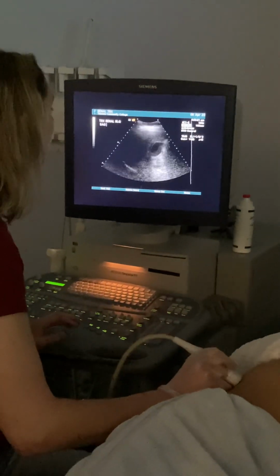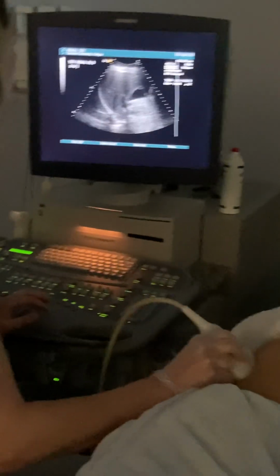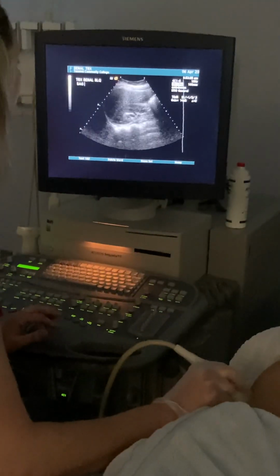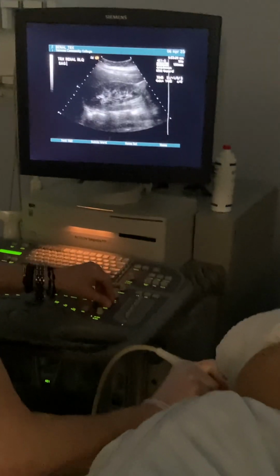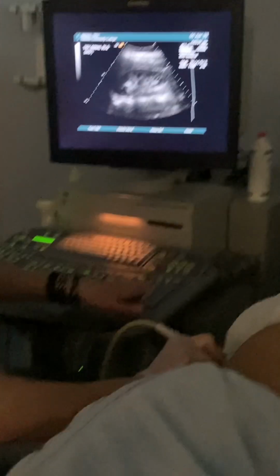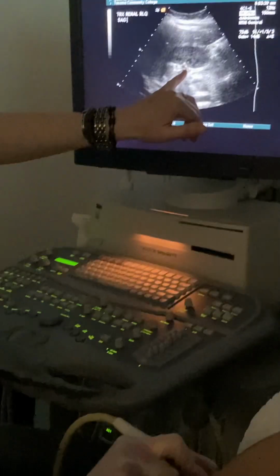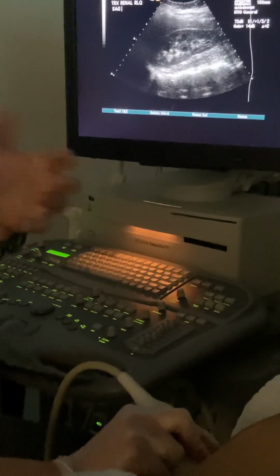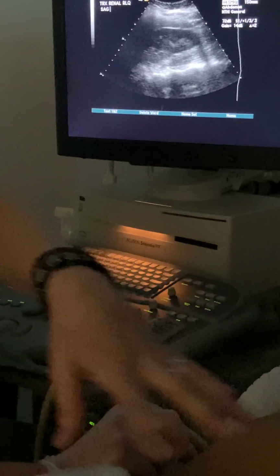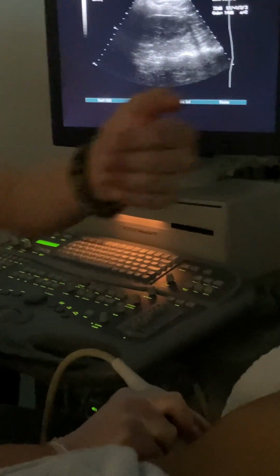Nice gallbladder. Look at that thing. And so we would get our regular sagittal image, the same that we would do for normal kidney. So SAG, medial is always going to be closer to where that vasculature is, so the lymphatics, ureter, vessels entering in. Lateral is always going to be opposite to that. So depending on where your patient's kidney is, medial, lateral.